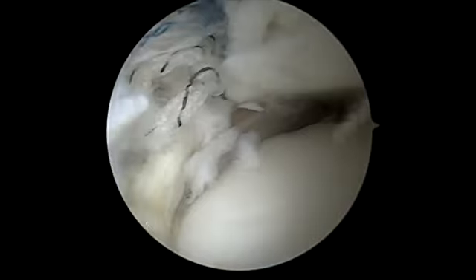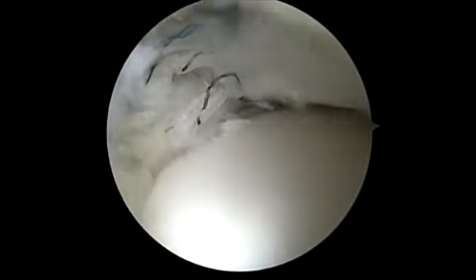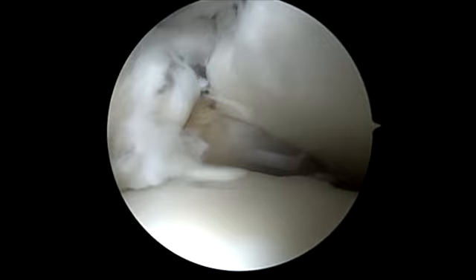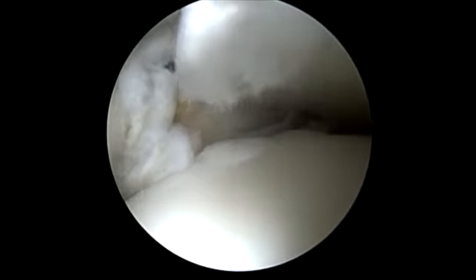After the correct implant position is confirmed and joint stability is checked, the wounds are closed and sealed with a sterile dressing. Thank you.